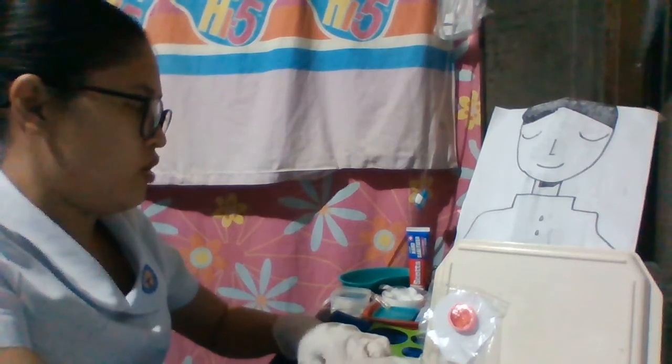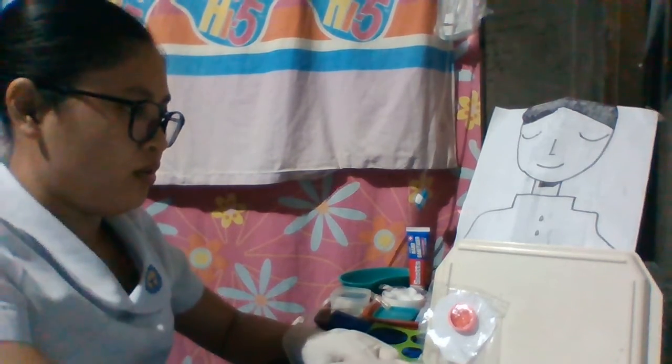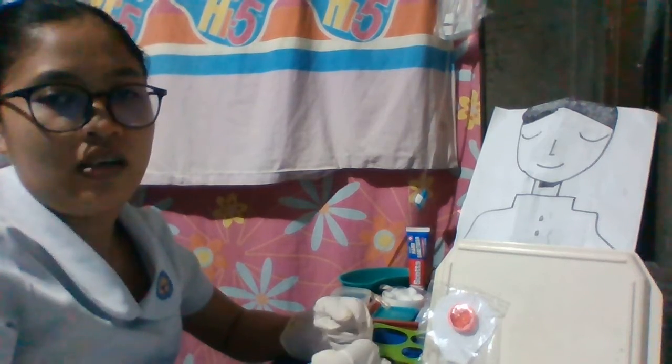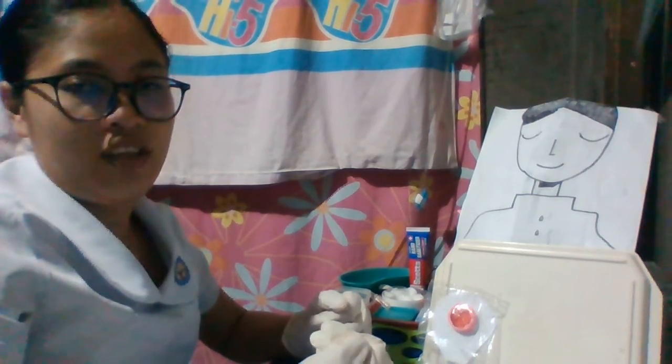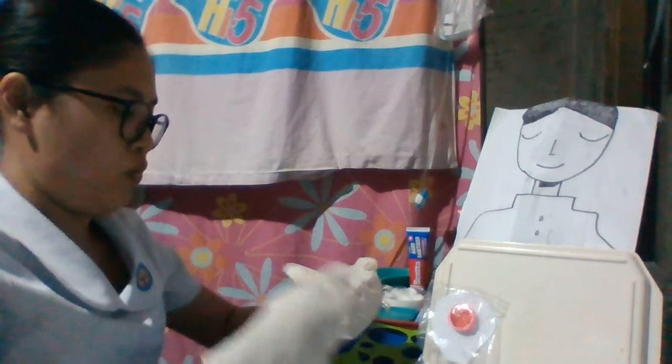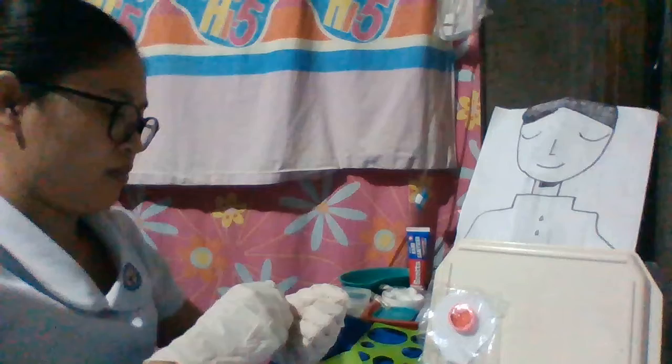Then we're going to dispose of the old appliance in the appropriate trash bin, remove gloves, then wash hands.